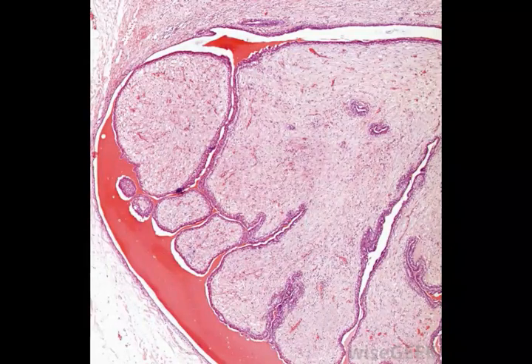A breast lump could also be a simple cyst which, being fluid-filled, has an anechoic, rather than a hypoechoic, center surrounded by a well-defined wall. Again, this is a benign, or non-cancerous, mass and can be treated by draining the contents using a needle.